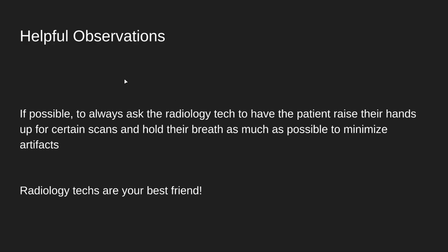So of course there are some always helpful observations when it comes to radiology technologists. If possible, it's always best to ask the radiology tech to have the patient raise their hands up for certain scans and hold their breath as much as possible to minimize artifacts. As you know, as a general rule in radiology, the radiology technologists are your best friend.